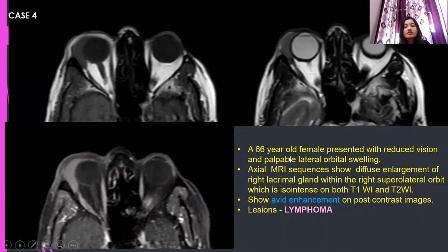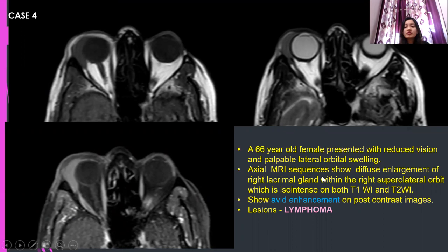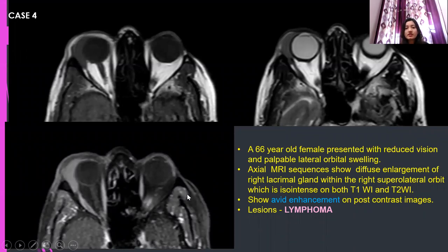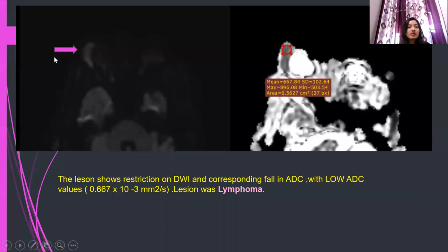Case 4: a 66-year-old female presented with reduced vision and palpable lateral orbital swelling. Axial MR sequences show diffuse enlargement of the lacrimal gland in the right superolateral orbit, which is isointense on both T1 and T2, showing intense contrast enhancement. Diffusion restriction is present with a fall in ADC, mean being 0.667 × 10⁻³ mm²/s. It was a case of lymphoma.